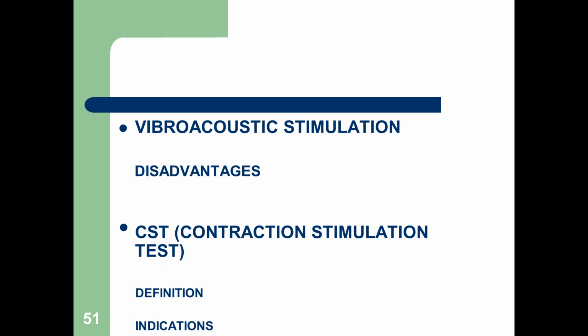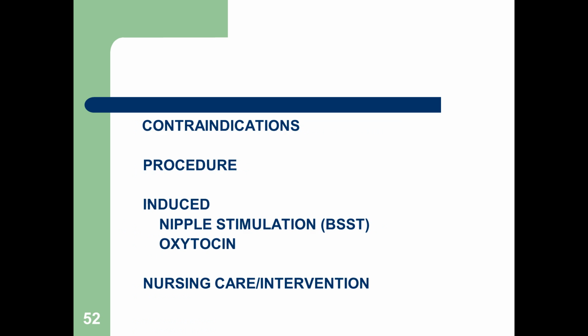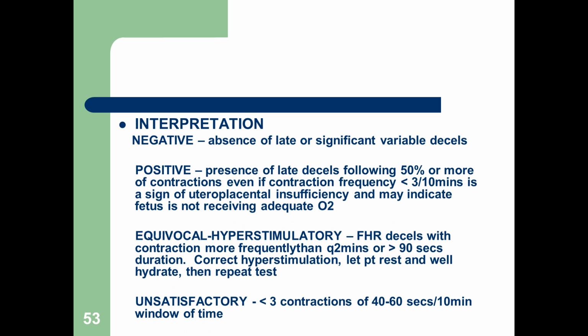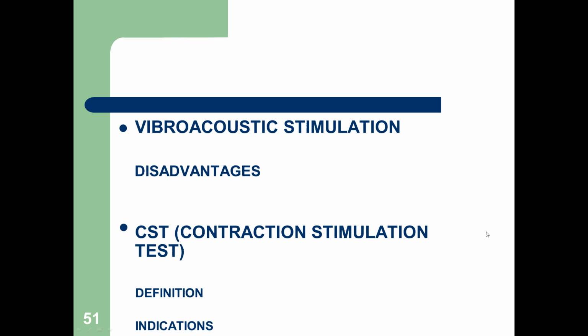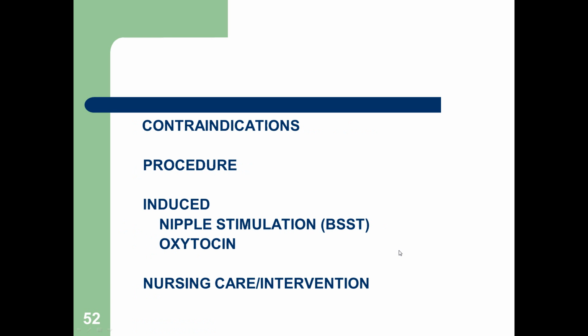Contraction stress test, that's the contraction stimulation test. It identifies fetuses at risk due to intrauterine asphyxia. Now, here we go.